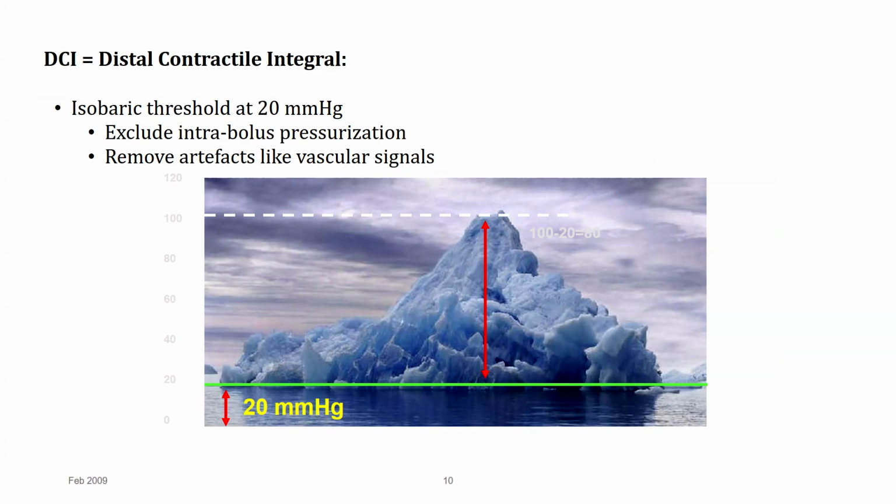There is pressure inside it even when I am not swallowing, and this pressure is also because of the organs surrounding the esophagus. What I am going to measure during the procedure is the contraction of the swallow. So that means I have to detect this pressure that is already in the esophagus.